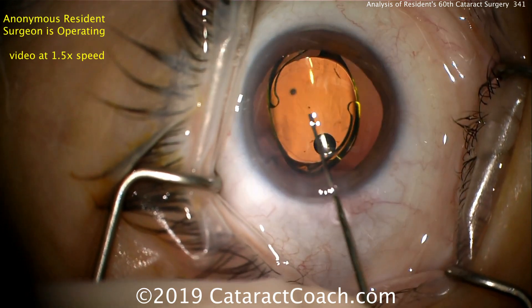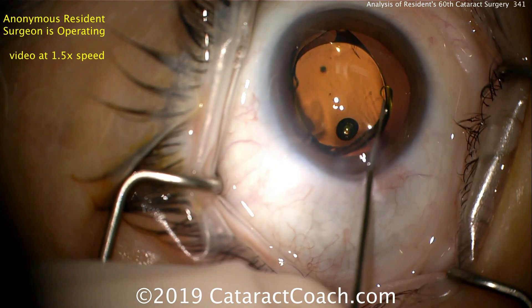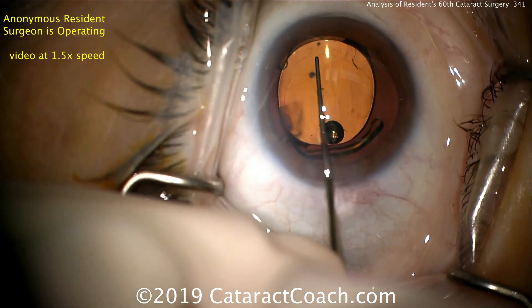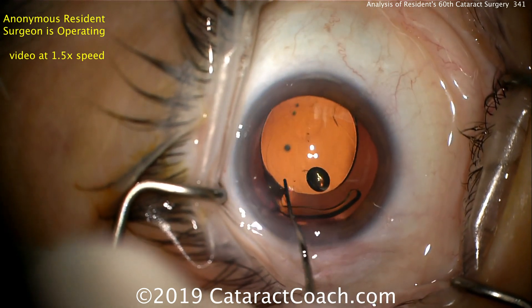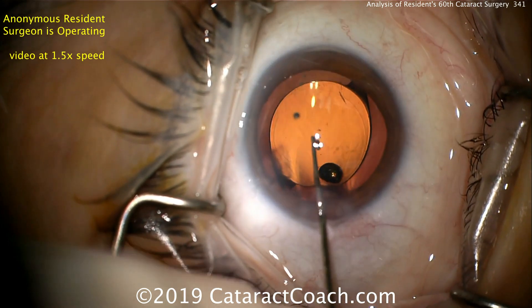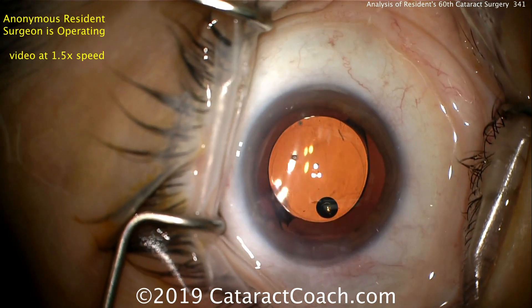At the beginning, though, in your first few dozen cases, I encourage you to load the lens yourself. You need to be able to set up the machine, load the lens, and do every step of the procedure by yourself. What if one day your technician's not there? You need to be able to continue.